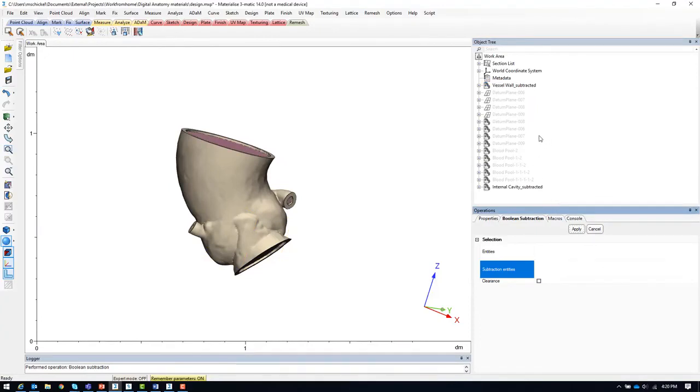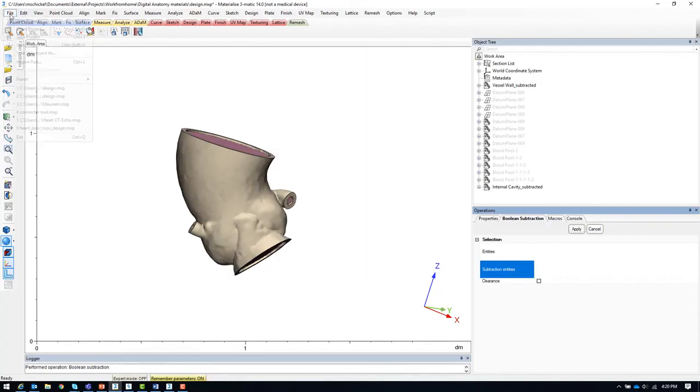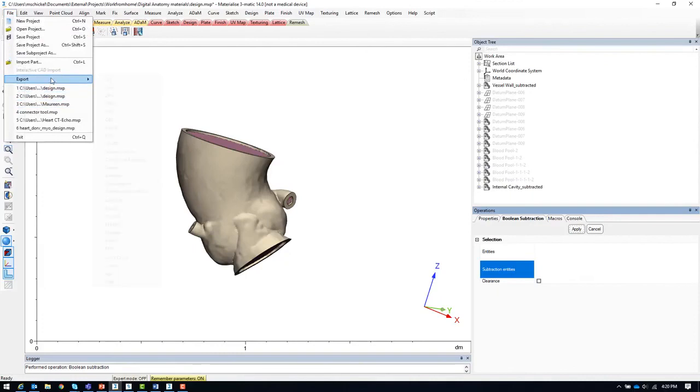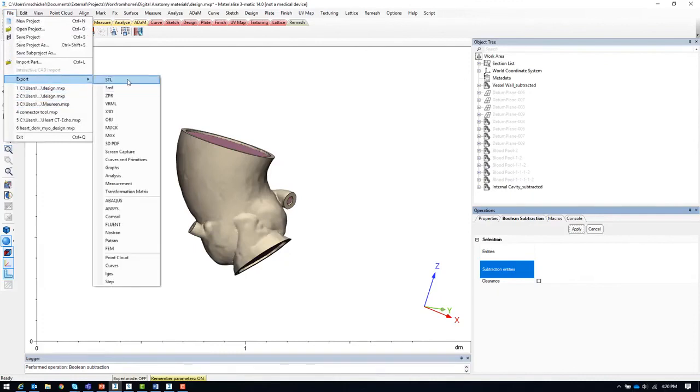Finally, we can take the resulting models, the calcifications, vessel wall subtracted, and the internal cavity subtracted models and export them as STL files to be used in the build preparation step.